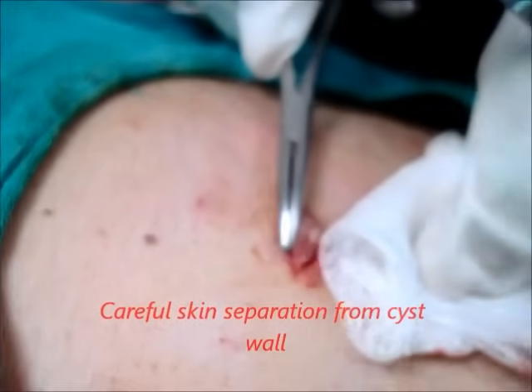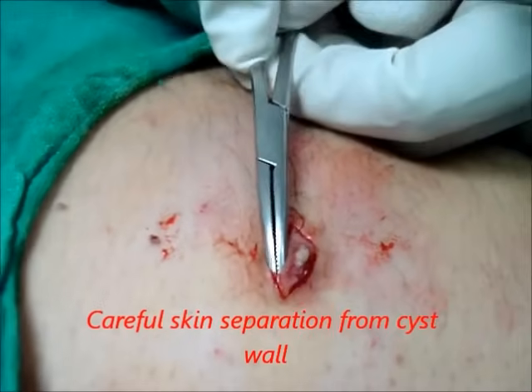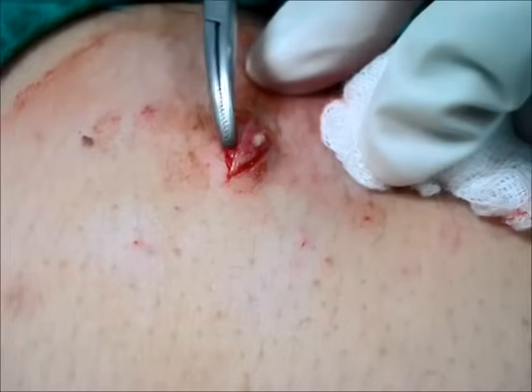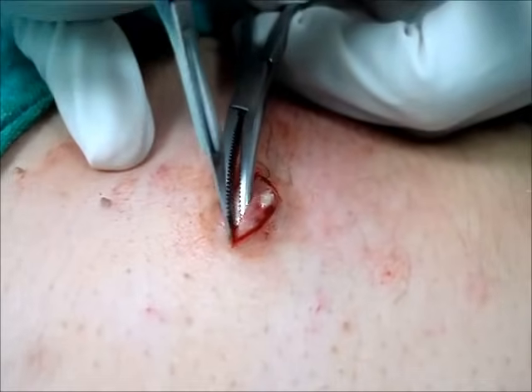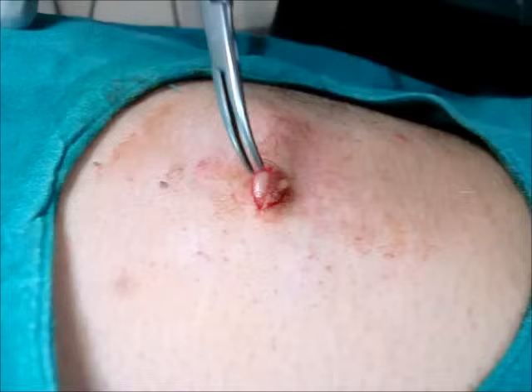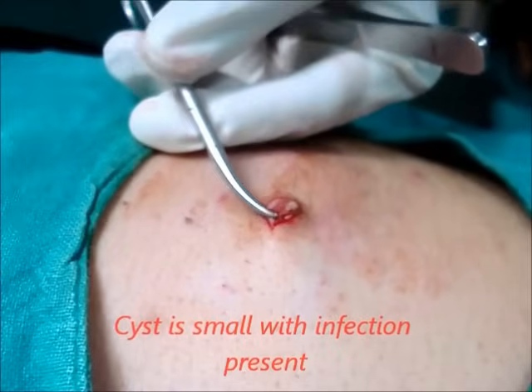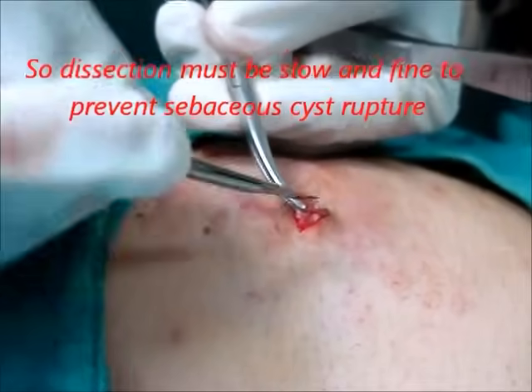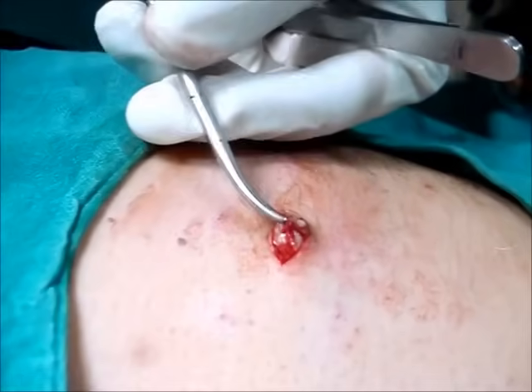I use artery forceps to get a better plane between the skin and the cyst wall. Careful dissection must be done to prevent rupture of the cyst — this is a small and also infected cyst, and a little carelessness can cause rupture of the cyst wall. I am dissecting fiber by fiber to get a better plane of dissection, using artery forceps or dissecting scissors for this step.